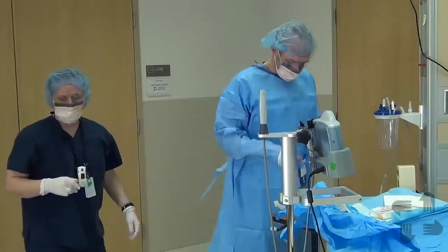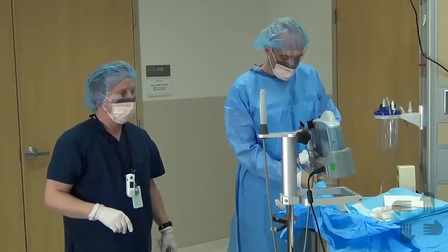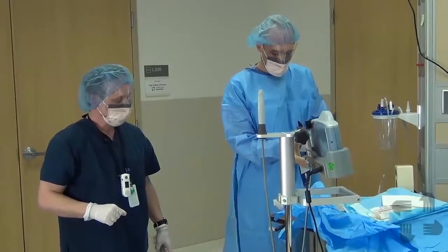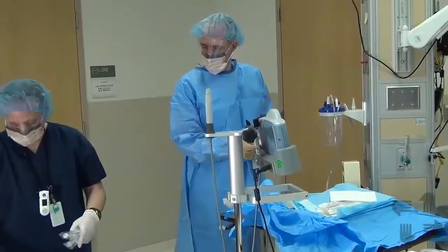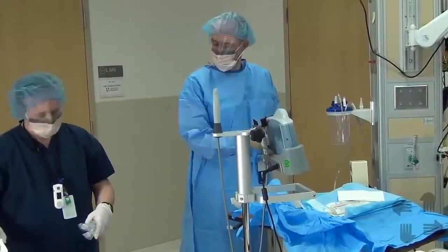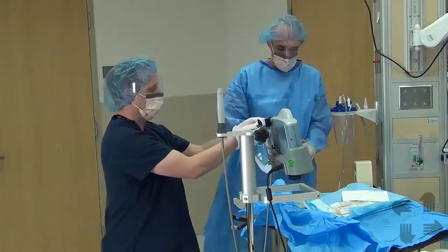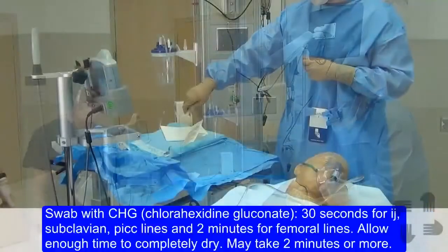Thank you, sir. You're welcome. And where would you like the flushes and the Heplocks, the ultrasound cover? Okay, so the ultrasound cover, I'd like you to drop sterilely into the kit here, and the 3 Heplocks as well, drop them sterilely into the kit. Okay.